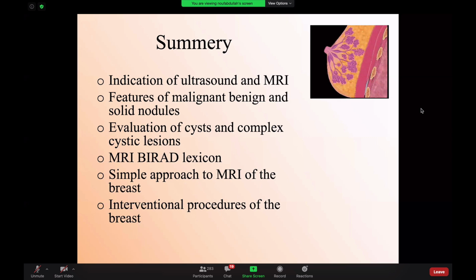Okay. Dr. Abdulaziz Al-Massan is asking, is there bi-rads 0 on ultrasound or MRI? That's a good question. So bi-rads 0 on ultrasound, usually no, you should be able to characterize it. Sometimes we use bi-rads 0 on ultrasound when you don't find a finding on mammo or ultrasound corresponding to each other. For example, you see an asymmetry or developing asymmetry on mammogram, and you do the ultrasound and you still cannot find anything correlating. What's your next step?